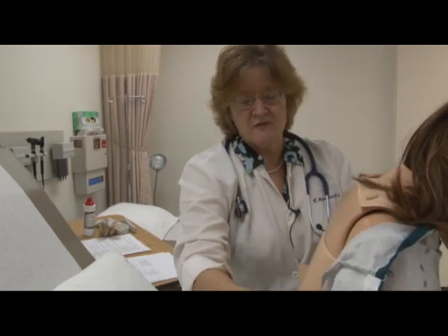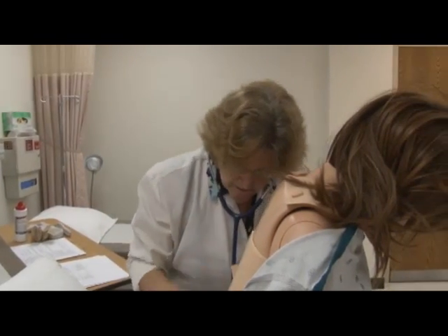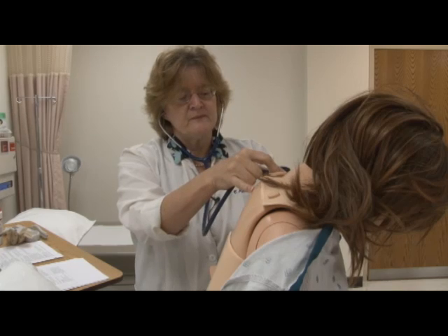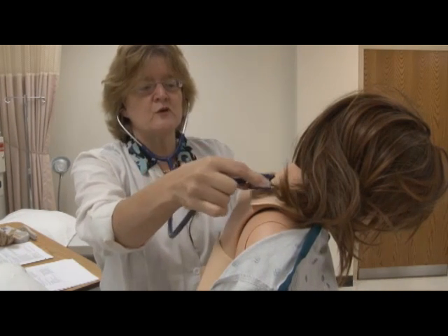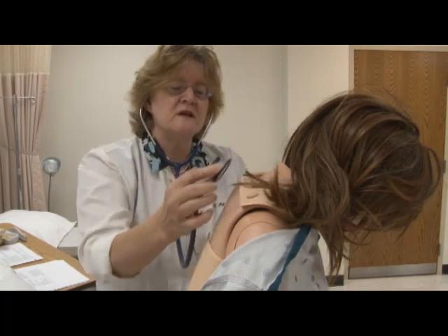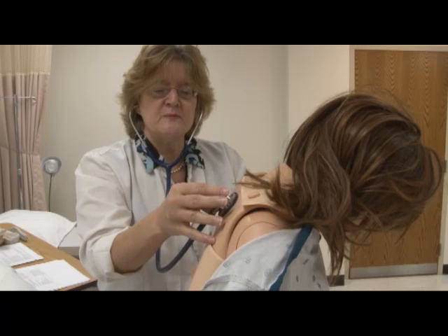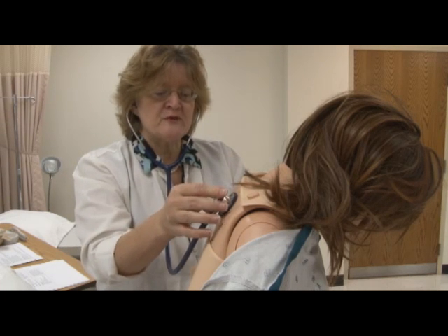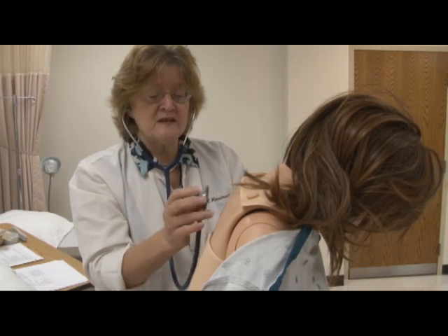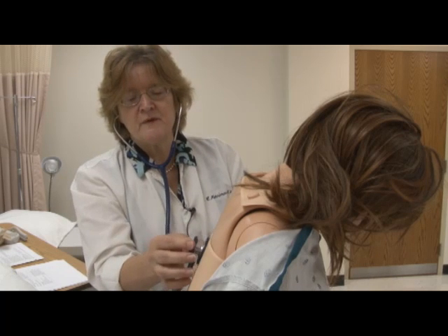Now I'd like to listen to your lungs — have you lean a little forward and I'll keep you covered. I'm going to start on the left side, right above the shoulders, because there's a little lung tissue there. Going across to compare. I don't want to hit the scapula, so I'm coming in towards the spine for my third and fourth sites. Make sure you're not on ribs.